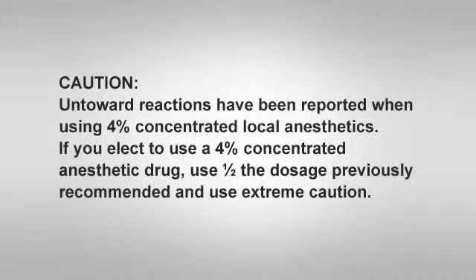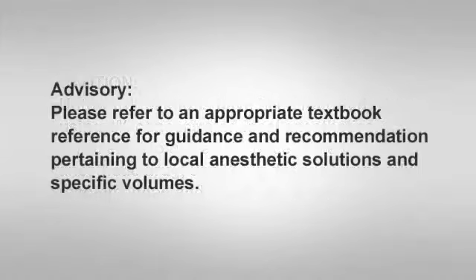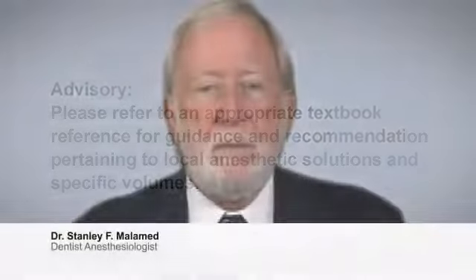If you elect to use a 4% concentrated local anesthetic drug, such as 4% articaine HCl, use half the dosage previously suggested and use caution when using these medications. Please refer to an appropriate textbook reference source for guidance and recommendation pertaining to local anesthetic solutions and specific volumes.